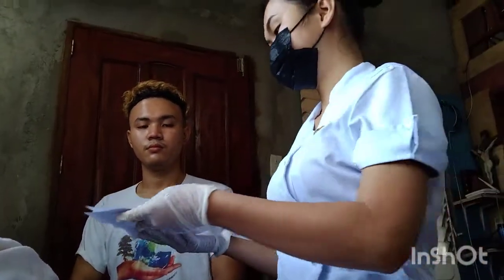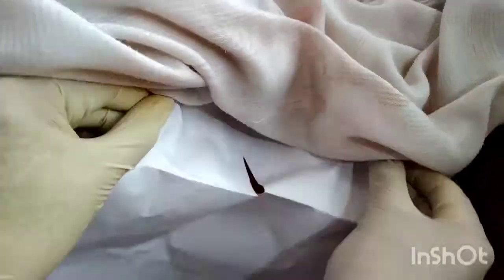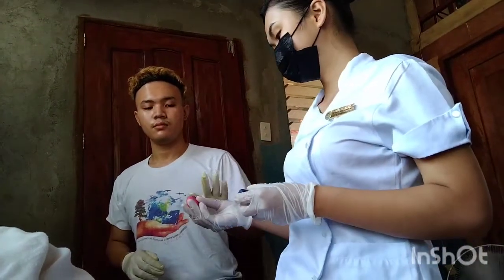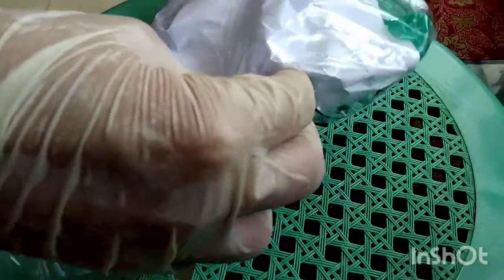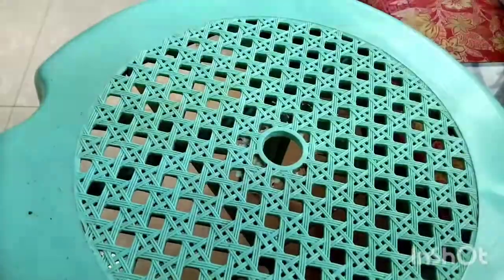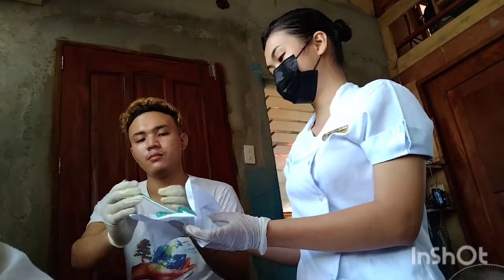Next is to observe sterile technique in offering pack of towel with hole for draping. This helps maintain sterility. Place adequate amount of lubricant over the non-dominant hand after the doctor cleanses urinary meatus. Pick Foley catheter of size according to age and remove outside pack, observing sterility, ensuring that the tip of the catheter will be offered for lubrication and insertion. Outside pack is unsterile. Doctor will pick the tip of catheter for lubrication.